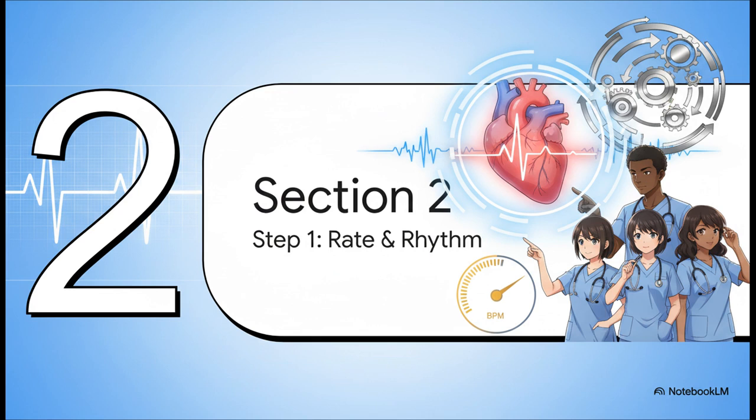And this brings us to Section 2, which is Step 1 of our system, rate and rhythm. I can't stress this enough. You do this first every single time. It's the foundation for everything else you're going to do.